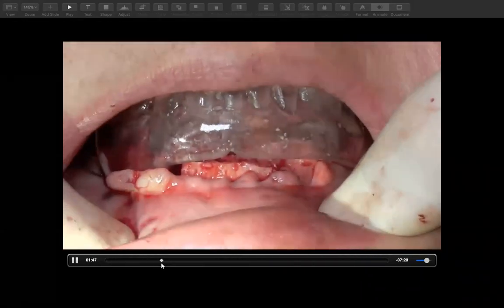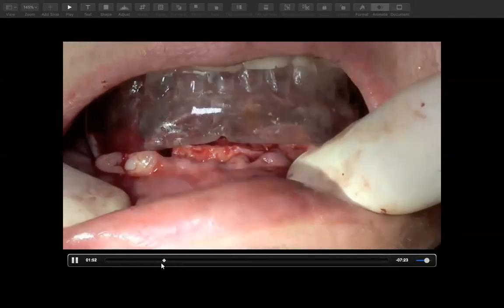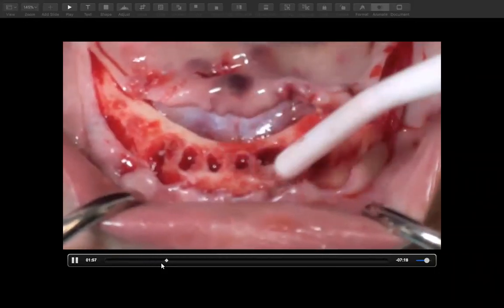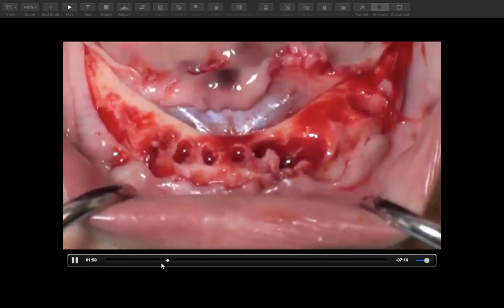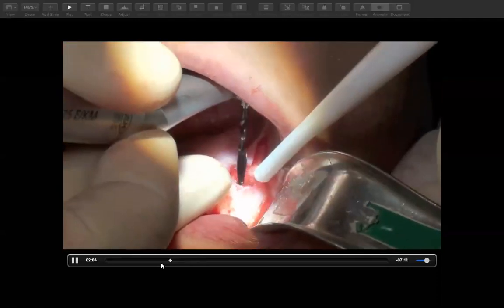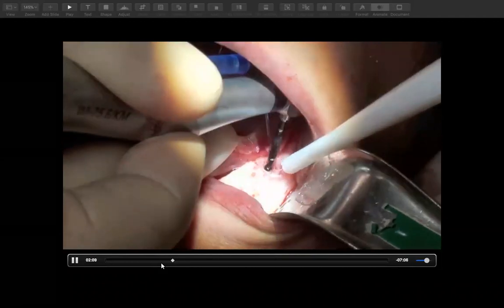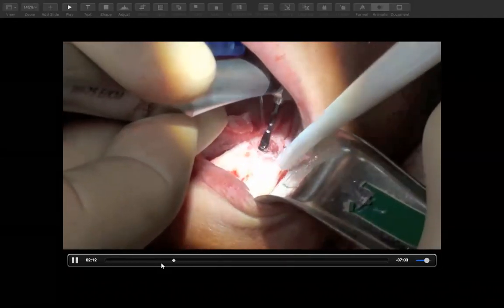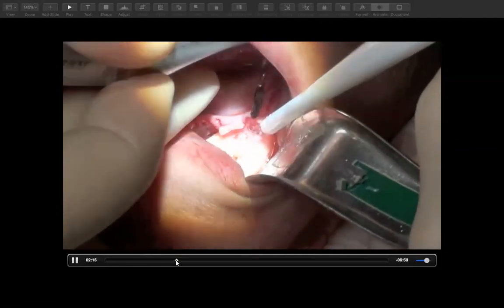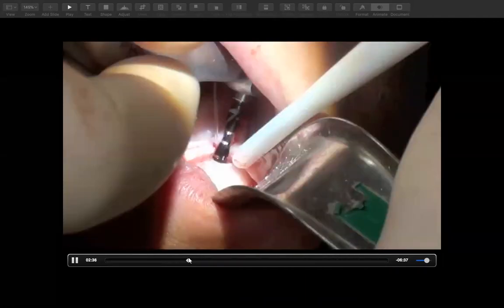Then they'll put the surgical guide back in, surgical stent, however you want to call it. You can see maybe on the left-hand side there, that bone needs to be reduced a little bit more. But typically this is what you see. A lot of times I'm not involved with this. Obviously it's between the surgeon or the dentist that might be placing the implants. They're going to drill their primary access drill, and then they'll step it up. Let me speed this up a little bit.